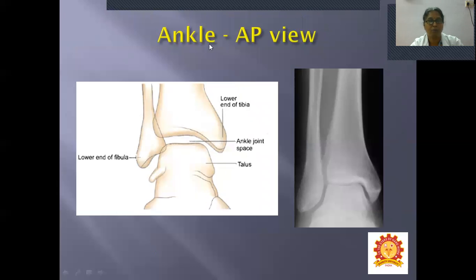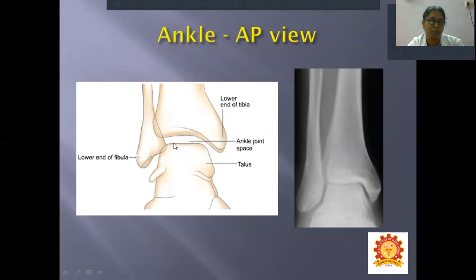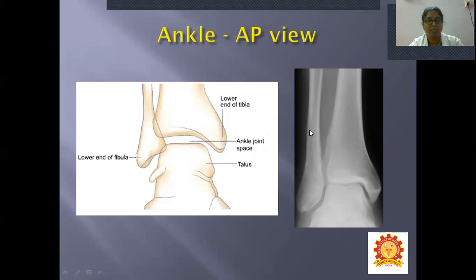Moving to the ankle — AP view. The lower end of the tibia and lower end of the fibula are visible, with bony projections called malleoli: the lateral malleolus from the fibula and the medial malleolus from the tibia. The space between is the ankle joint space. Below is the talus.